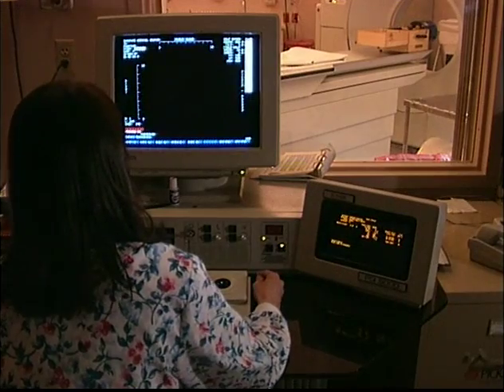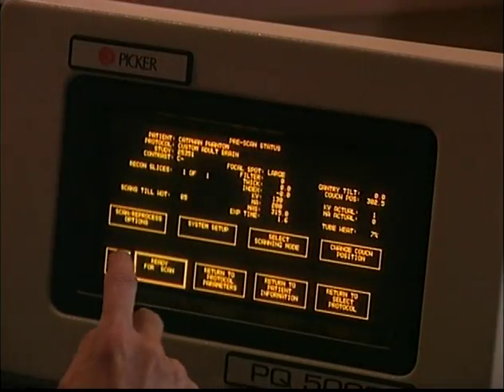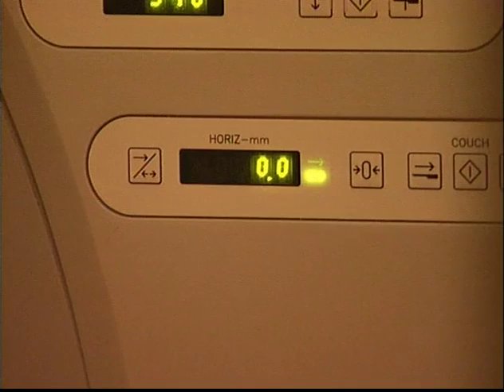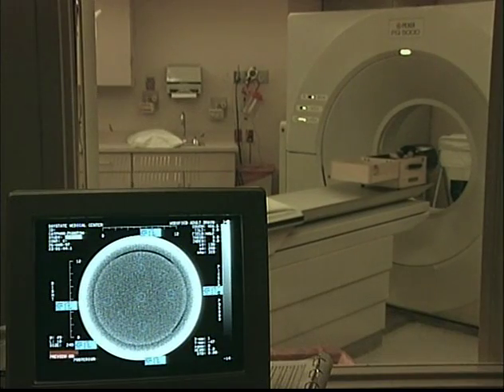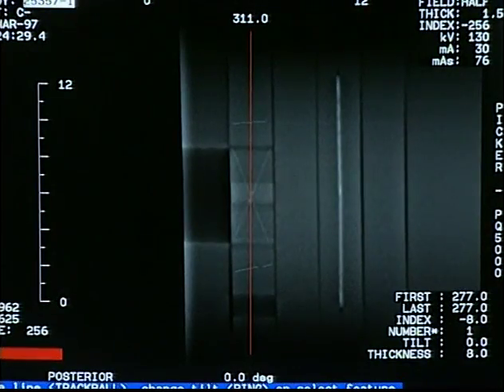Test centers in the modules are spaced at specific intervals, allowing different test modules to be quickly scanned without repositioning the Catphan Phantom. Begin with a scan of the first section, CTP 401, at the 0 mm table position. The center of this test section can also be located on the scout view where the wire ramps cross.